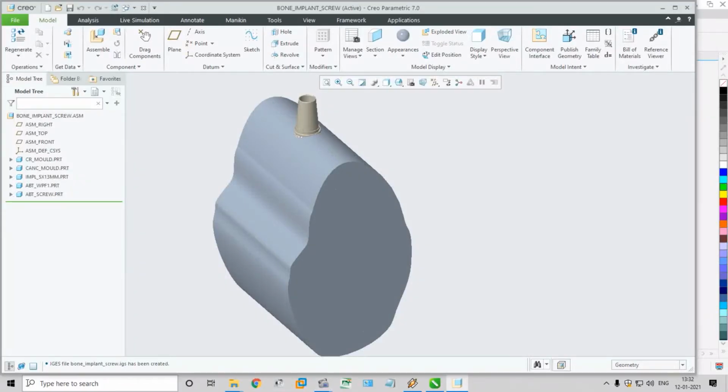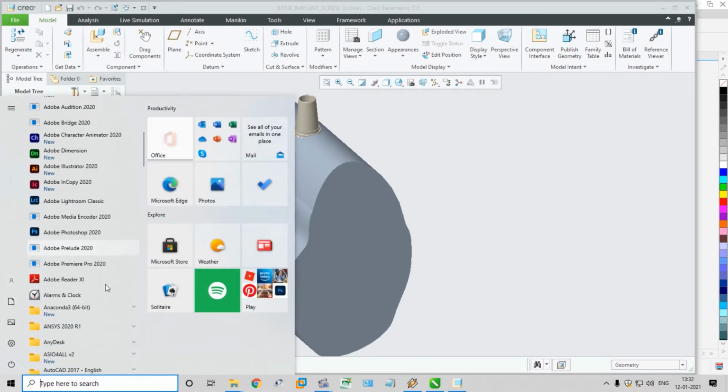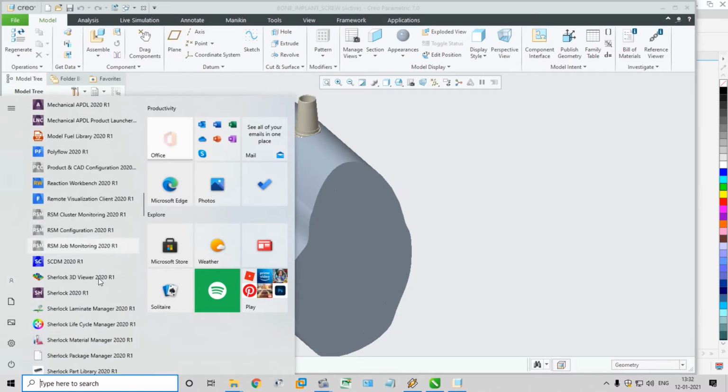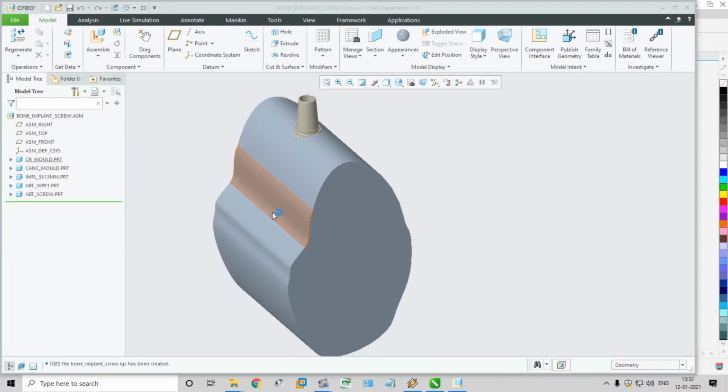Okay, finite element analysis, how we can do. Next, step by step instructions. Open ANSYS Workbench.